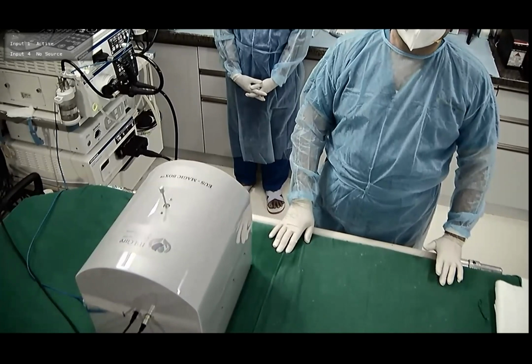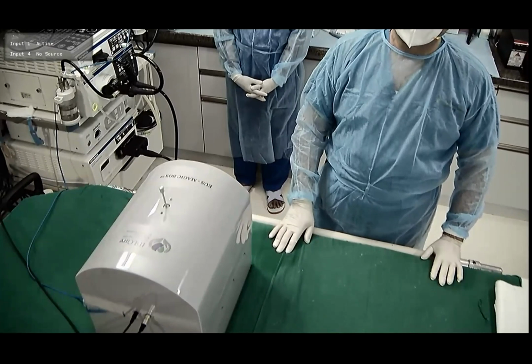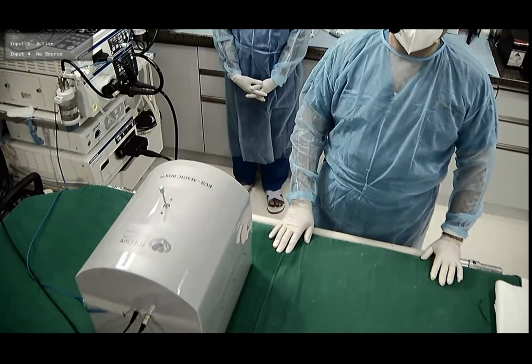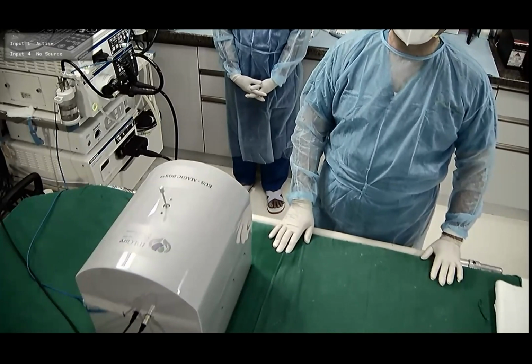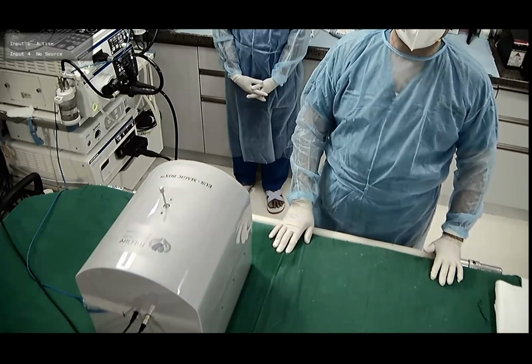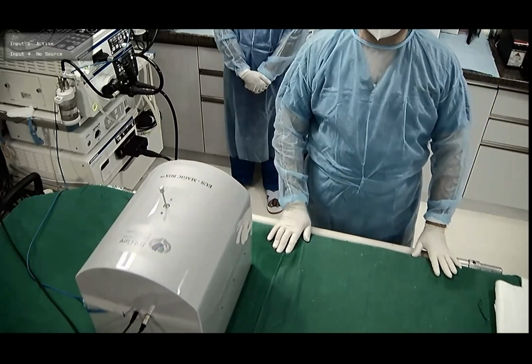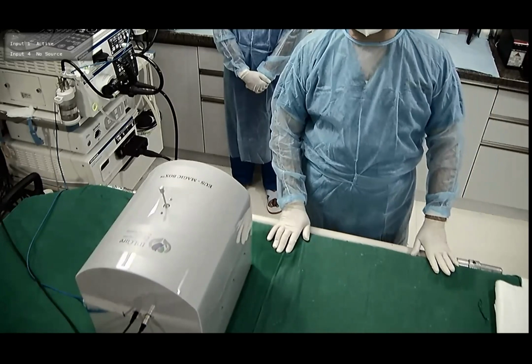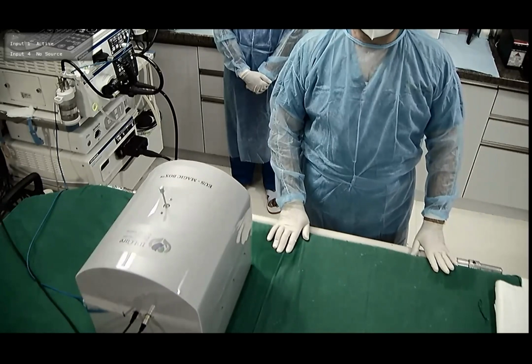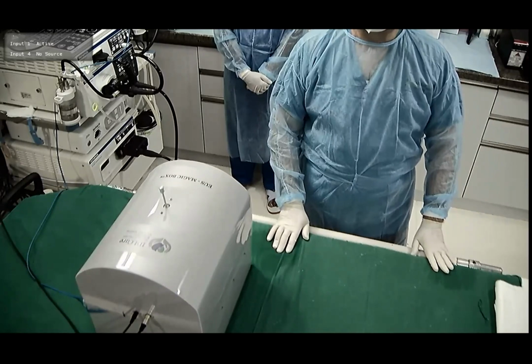Our second model was also specific to EUS-BD, and we could do CDS, rendezvous, antegrade, and other procedures in that. This is the third innovation in that same series, because as we go on, we learn from the mistakes. One problem with that model was it could only be used under fluoroscopy. So we needed a model which could be used without fluoroscopy, so it could be used in conferences also.